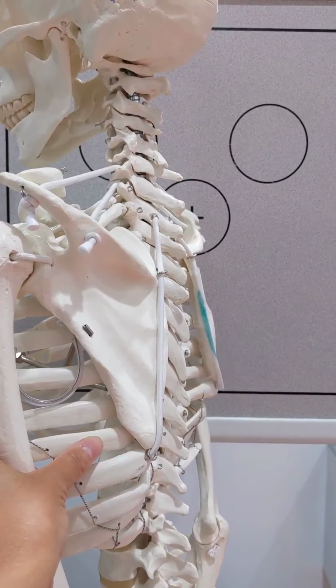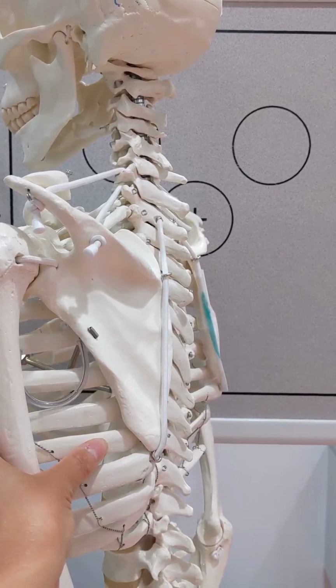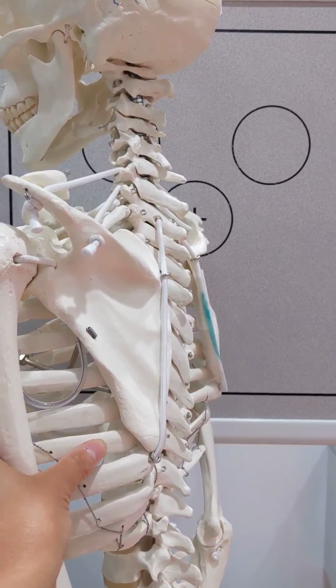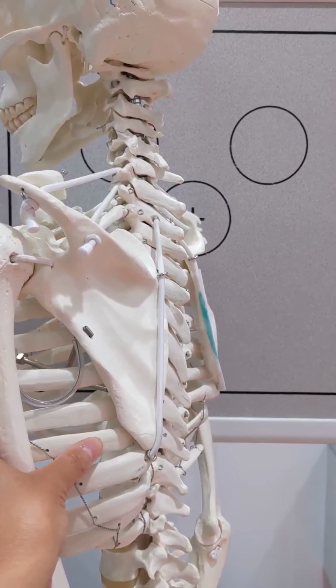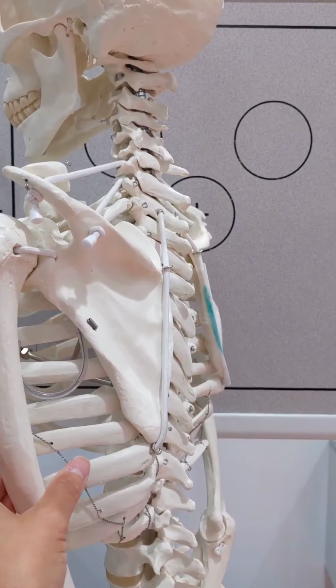Obviously we can't see through bone, so the red line of the lateral border of the scapula is immediately superimposed or behind the green line or the medial border of the scapula. And that's our goal for this projection.